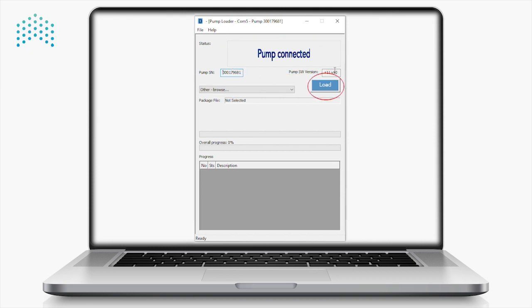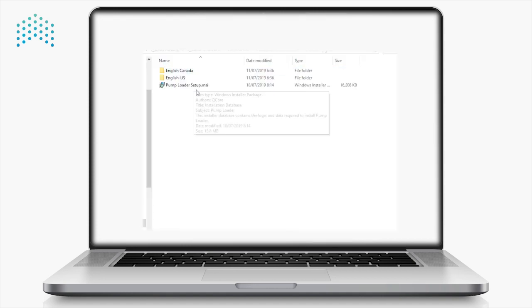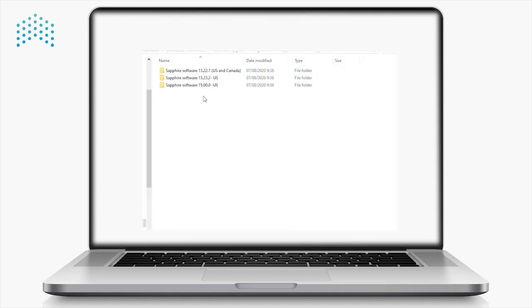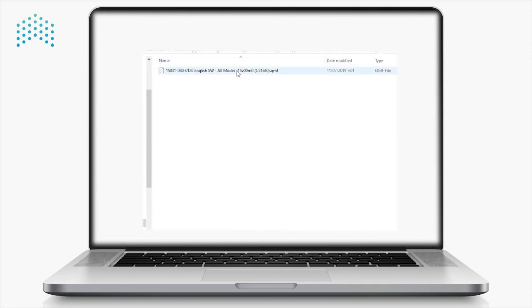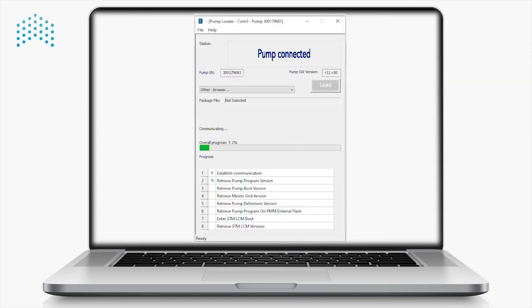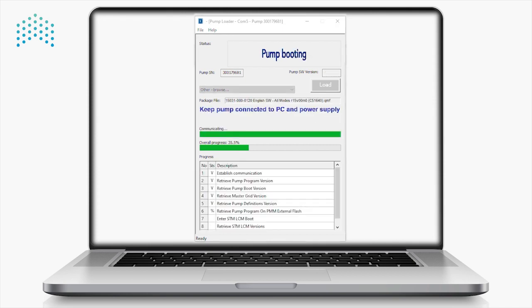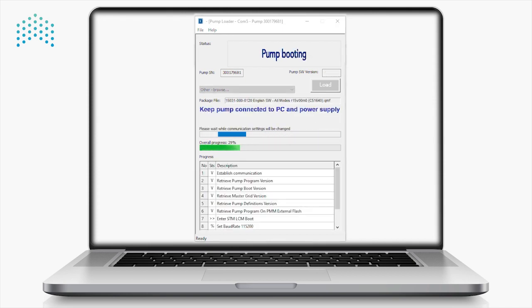Click on Load to Browse and find the approved software revision you wish to install in the Software Upgrade folder downloaded from the FTP. Once the file is selected, the upload process will begin automatically. Be sure not to turn off the pump or disconnect it from the computer while the upgrade is in progress. It is also recommended to disable sleep mode on the computer.